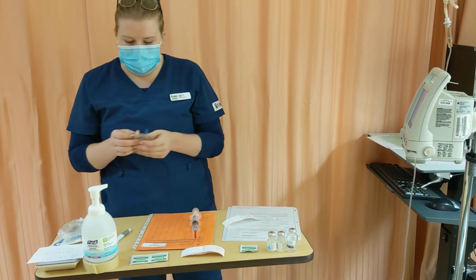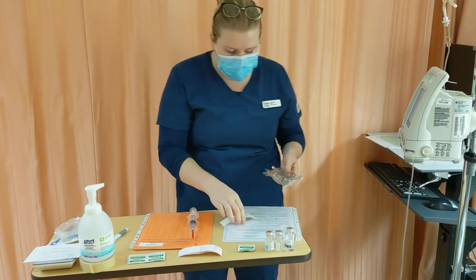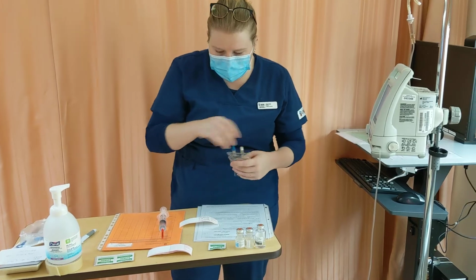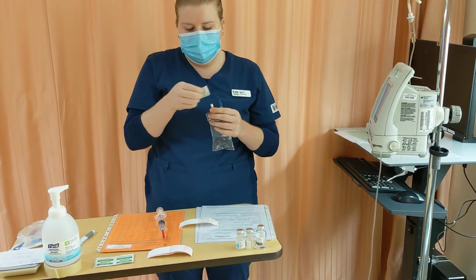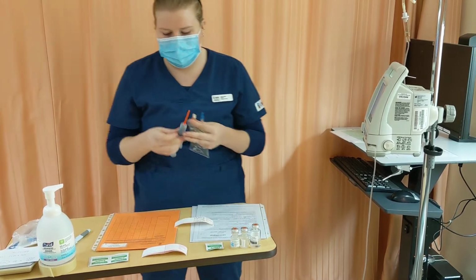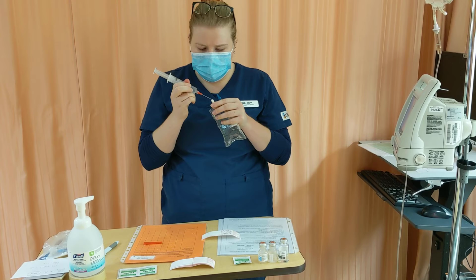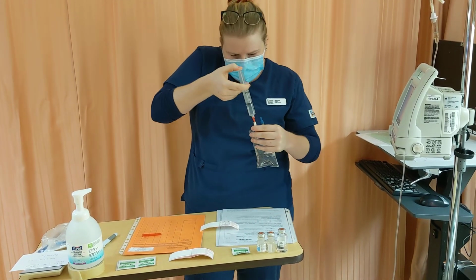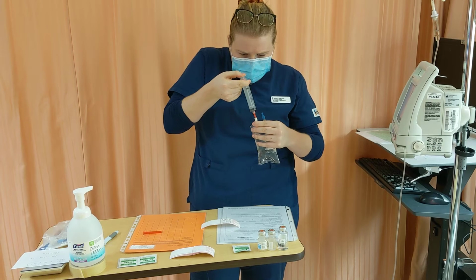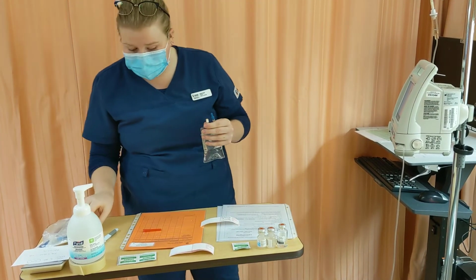Like I said, I've already checked that this is the correct mini bag, so 100 ml of normal saline, and we've checked that it is not expired. I'm going to grab my alcohol swab and swab the port for 30 seconds in a circular motion, let it dry for 15. Still my medication, not breaking sterility. Okay, there we go, so that's correct. I'm going to take this and it's going to go directly into the sharps container.